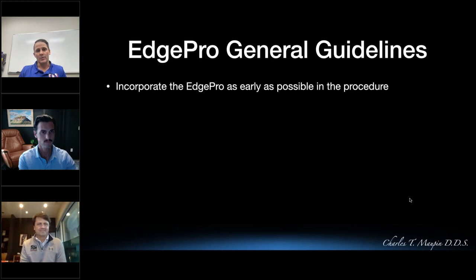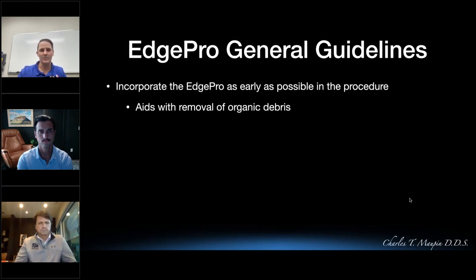Again, what I'm going to do is just talk about the technique of it today, and then I'll pass it over to Dr. Anderson and Dr. Butler, and they'll share their experiences with it as well. But my guidelines are to incorporate the EdgePRO as early as possible into the procedure. Necrotic teeth, as soon as I access, I'm bringing it in and running through that. We'll go through that in a minute.